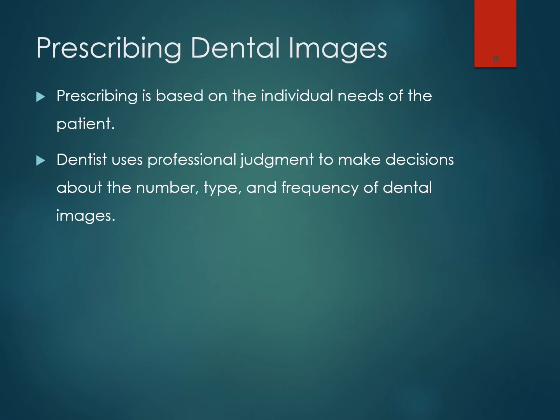Prescribing dental images. So in case you hadn't noticed, this is a pretty important topic. That's why we talk about this in almost every single chapter. Prescription of radiographs needs to happen from the dentist, and it needs to be based on the individual needs of the patient. Okay, I cannot stress to you enough how much we have to take into account the individual person when we are prescribing radiographs.